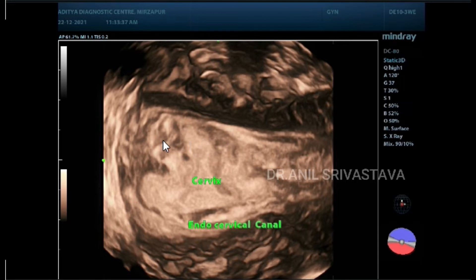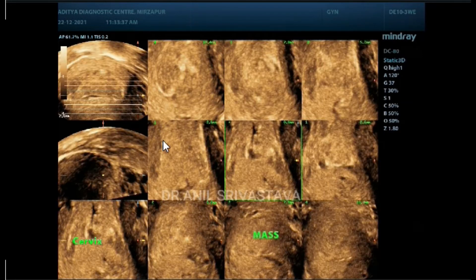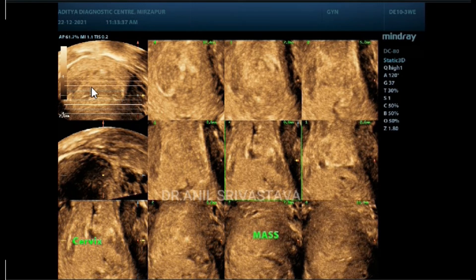Here is a tomographic view. You can see this mass — this is the cervix and the mass is present in the cervix.